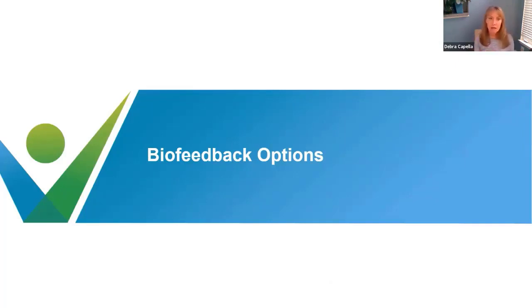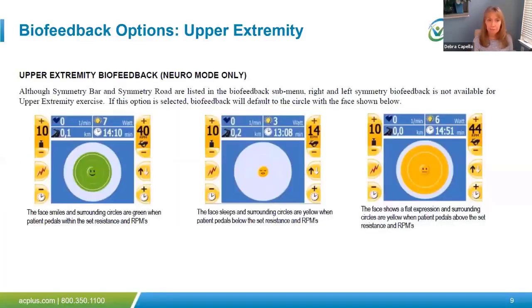And you're going to see that they will have some differences based on the level of cognitive ability the patient might have or the goals that the therapist has. Again, choosing the biofeedback is a skilled mental decision that the therapist is making before we start the exercise program.